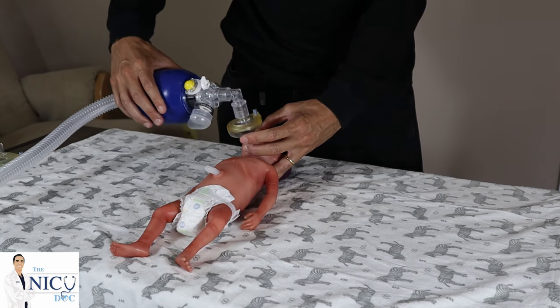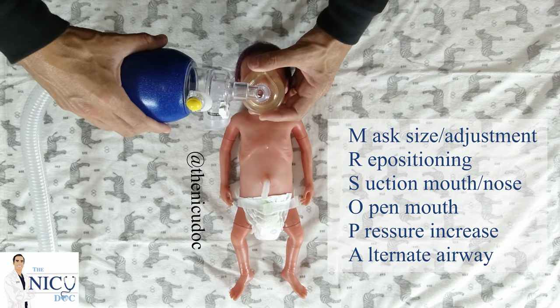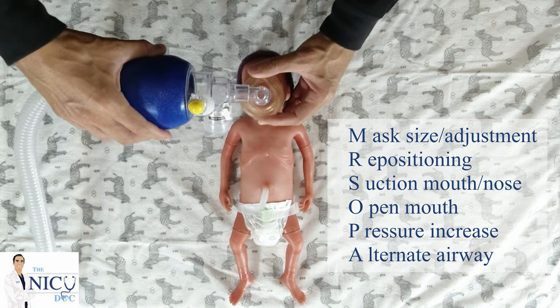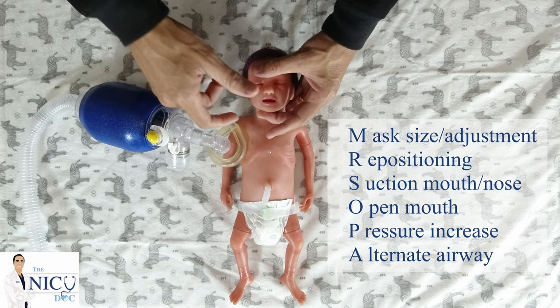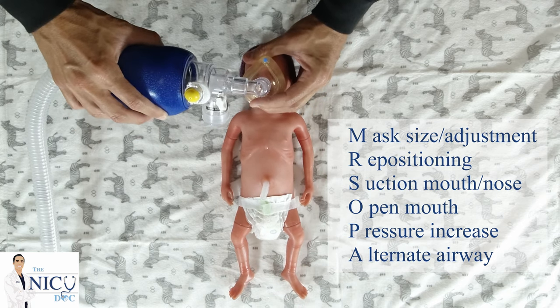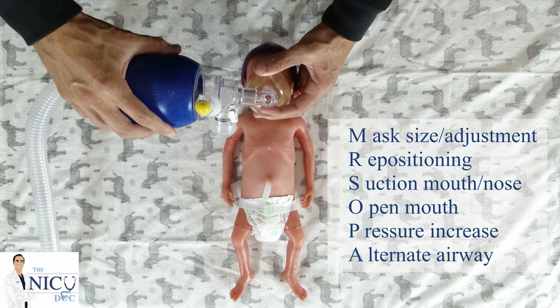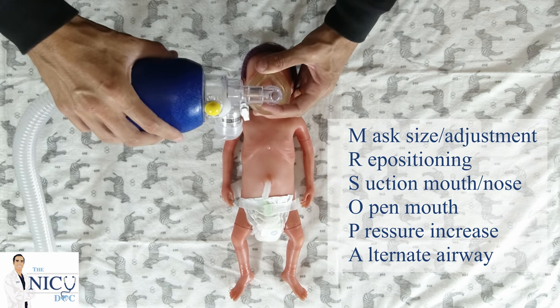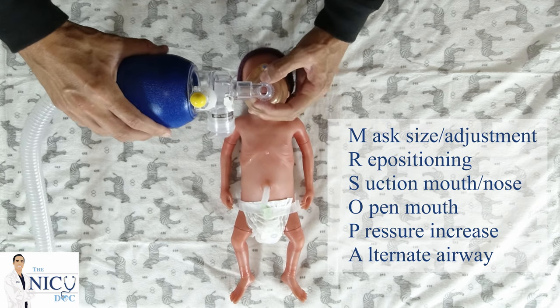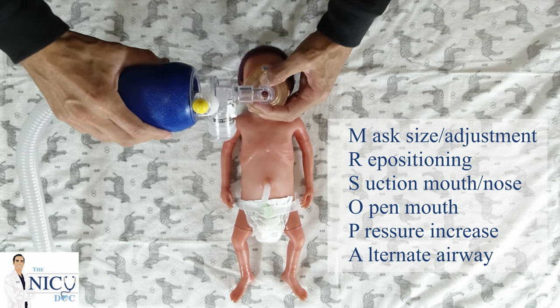I have shown you each example separately, but you do this essentially all together. If the baby is not getting good breath sounds or vital signs are not improving, go ahead and readjust your mask and reposition the baby. If you see bubbles or something obstructing the airway, you or an assistant can suction the nose or mouth with a bulb suction or suction catheter. Sometimes the baby's mouth may be closed, so you may need to open the mouth and readjust your mask. If you're not getting good pressures, ask your assistant to increase the pressure — either on your device or on the wall — as the opening pressures may not have been enough to get the lungs to open up.